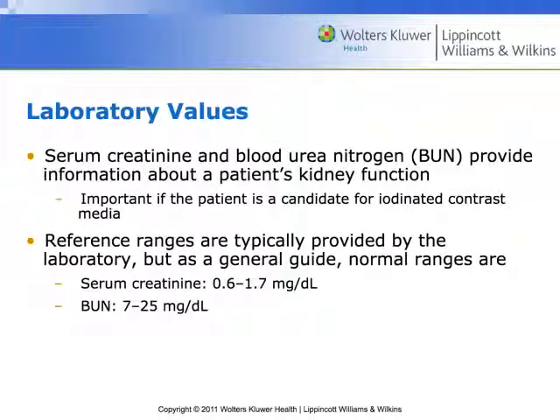Lab values. These are really critical, right? If I've got a person who's totally comatose, had a seizure, whatever, they're non-responsive, this is the next thing I'm looking at. What are their lab values? Patient non-responsive. Patient unable to listen to breathing instructions, right?